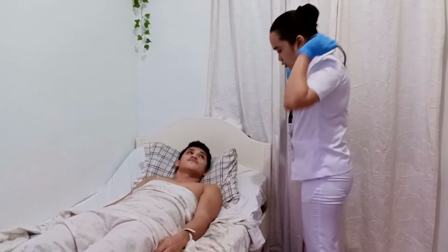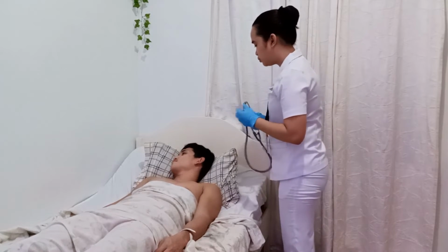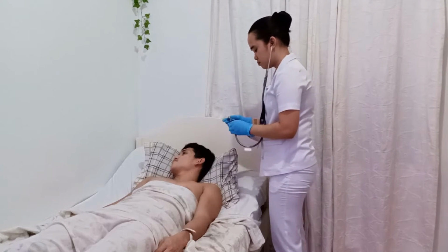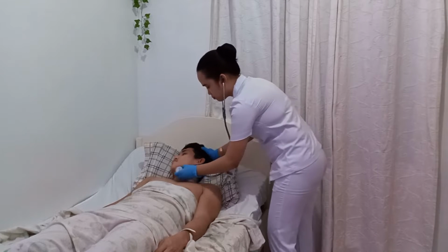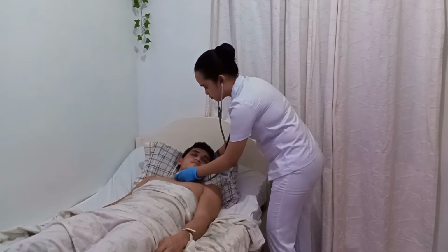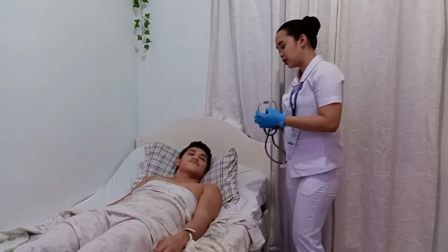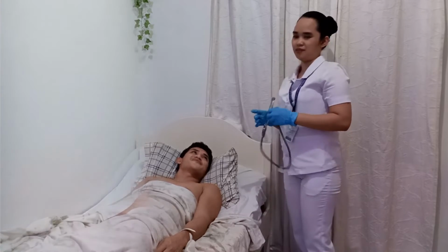So, Mr. Patrick, I need you to tilt your head a little bit. Okay, and then hold your breath for a moment. The other side. Okay, Mr. Patrick, upon auscultating your carotid artery, there is no sound. That is good.